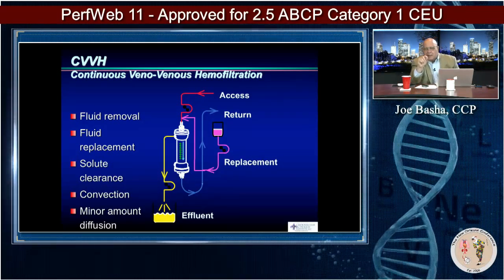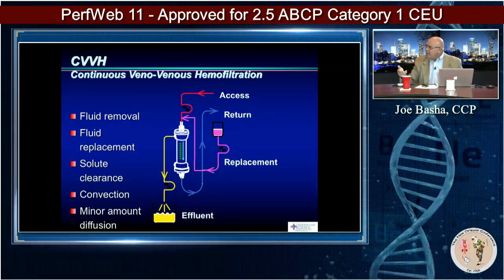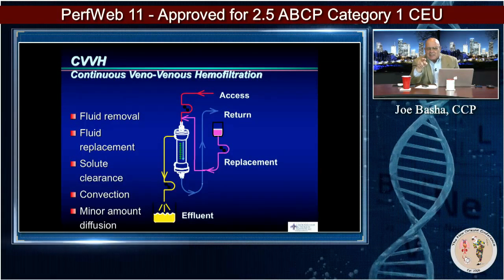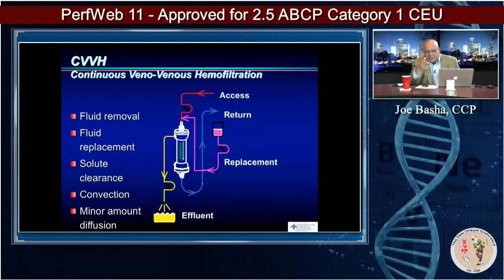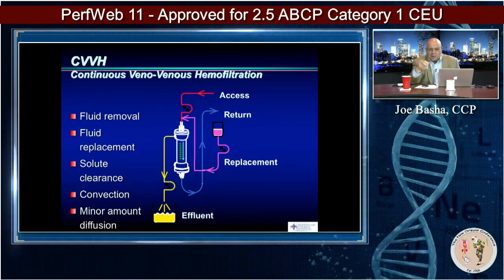And this is something else. In perfusion world, red is always left. I was going to say that. Left. Yeah. In the dialysis world, it's opposite. Access is red, as opposed to, in our world, red return. So keep that in mind. When you're looking at a dialysis catheter, the red is the access, the blue is the return. And that's because it's been concentrated and that's how they distinguish those colors. But it's exactly opposite of what we're used to.